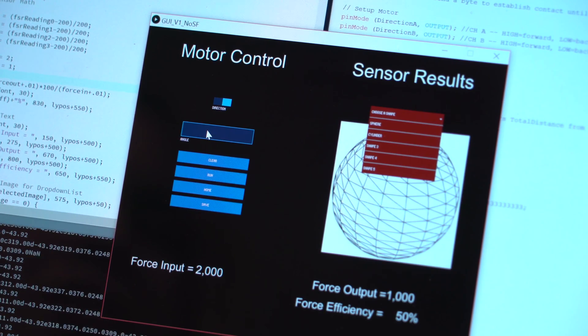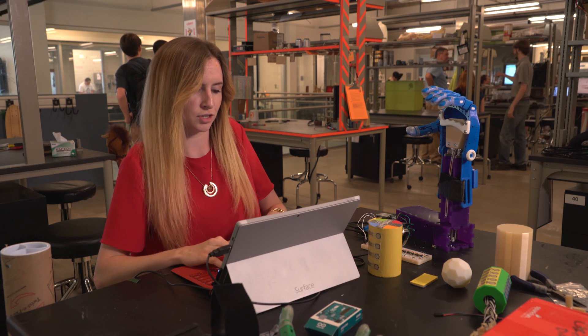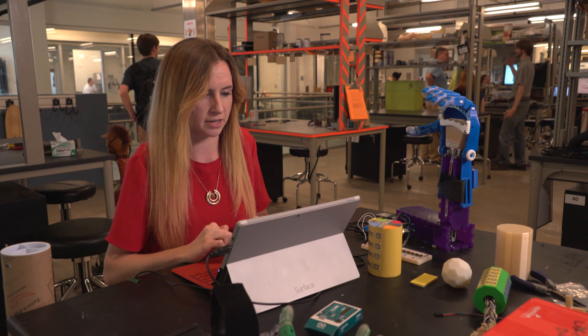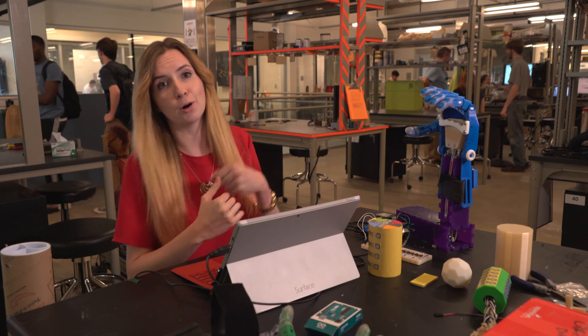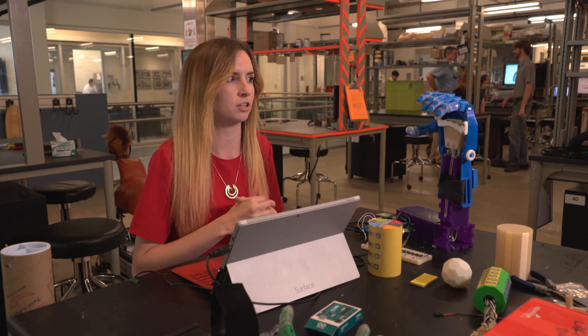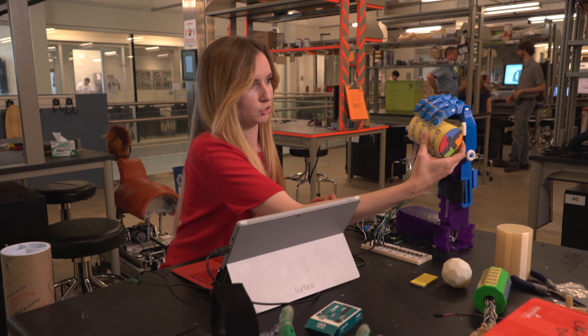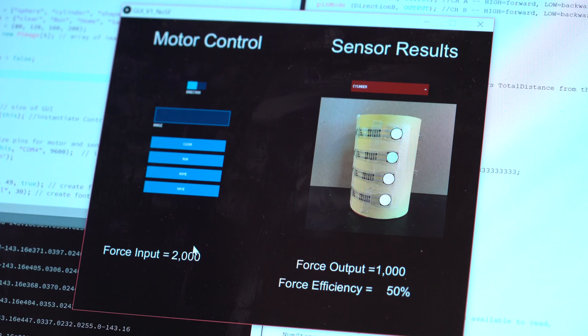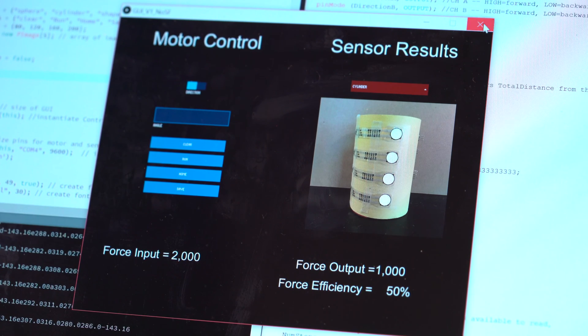You type into our GUI first what direction you want by switching the toggle button, and then how many degrees you want to go — say, 30 degrees — and you run the program. With that, it's running the motor so you can see the hand closing around. You'd have some sort of object, such as the cylindrical sensored object, and you can see the different pressure distribution when pressing on the different sensors.